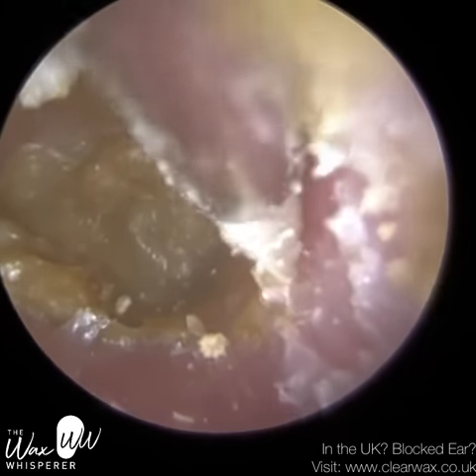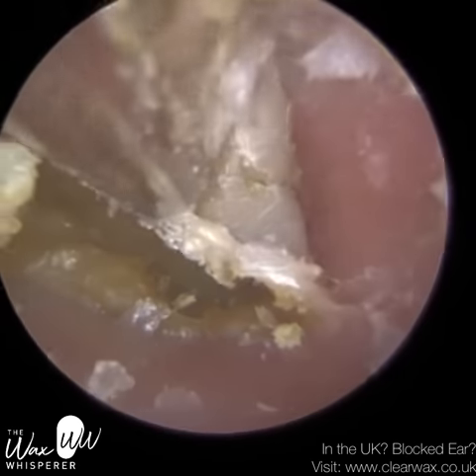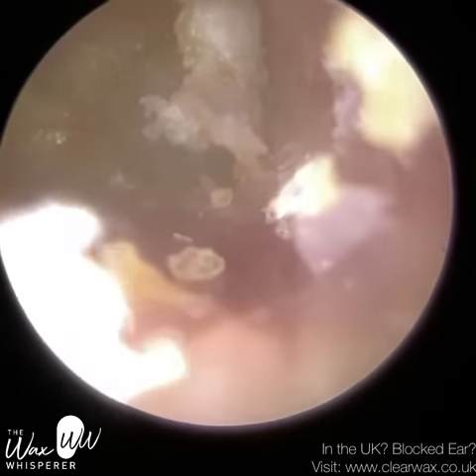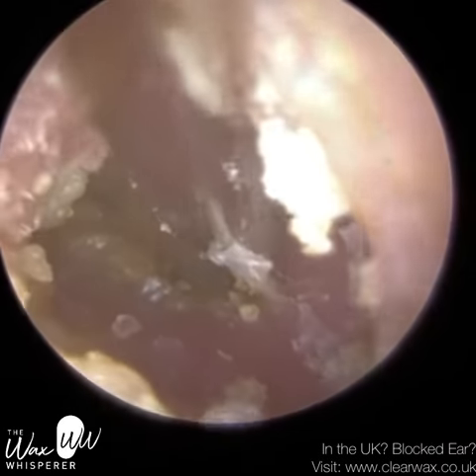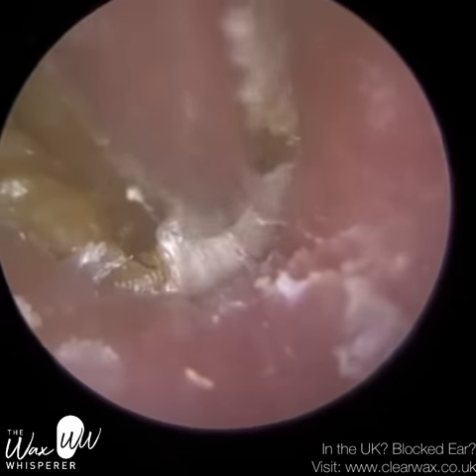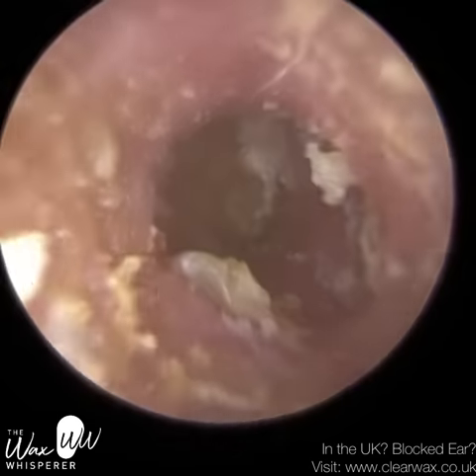On a normal clinic we allocate half-hour slots only, because most earwax removals are done within minutes. But nonetheless I always allow myself half an hour just in case we have really complex procedures. This was even more complex, and we did have a patient waiting afterwards. Knowing that I was going to be over, I went out to the reception room and spoke to my next client, just to advise that we are running a bit over and we don't want to rush the job. The patient was very understanding, which is always nice.